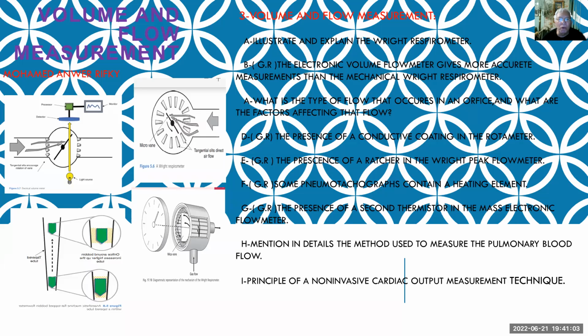I want you to have a look at the figure on the left downwards, where we can see the flow meter, which we'll discuss later on, to find the difference between the bobbin whenever it's in the upper part of this tubing system or in the lower part. You can see that the annular space, which is the space around the bobbin, between the bobbin and the tube, is much increased in the upper part than in the lower part.